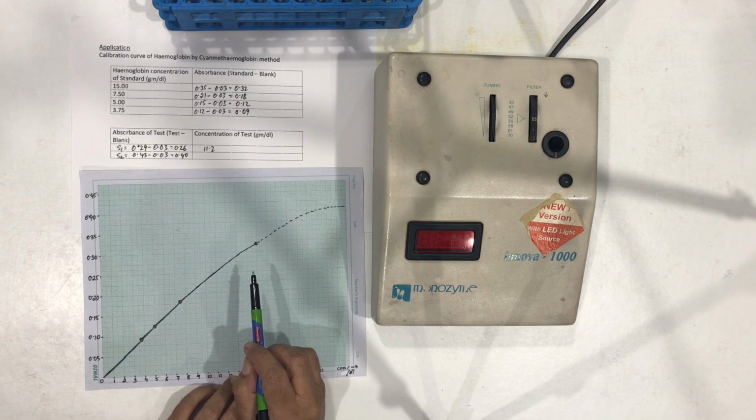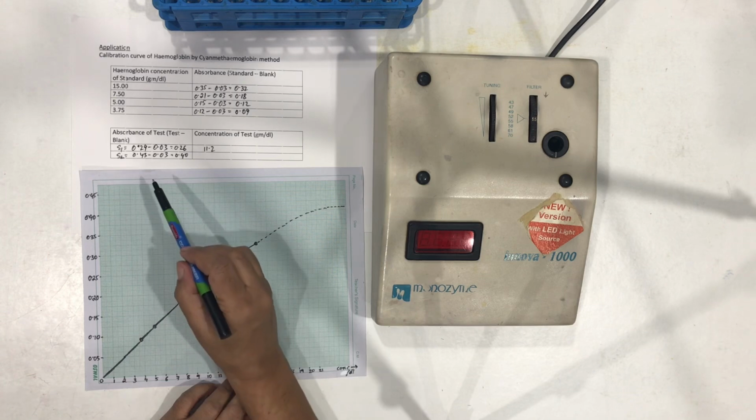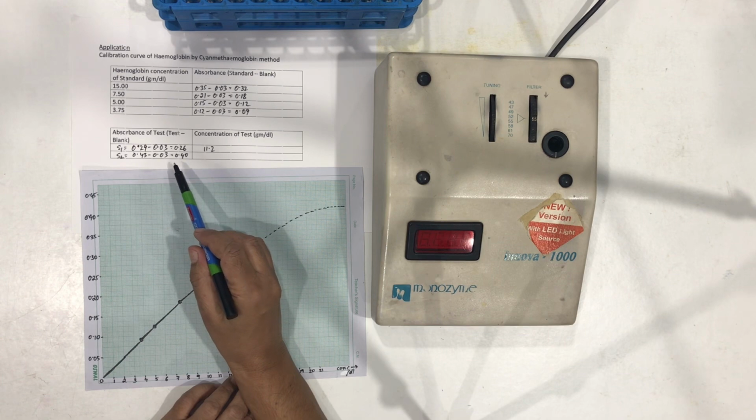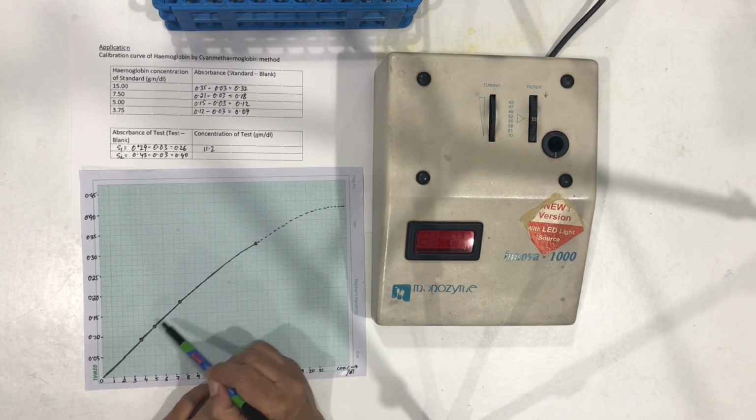That is why every test kit gives the linearity of the test. If your result falls outside the linearity, you have to dilute the sample and repeat the test. In this case, we have to dilute sample 2 and bring its absorbance from 0.40 to the linear region of the curve.